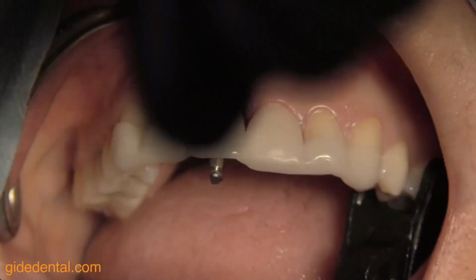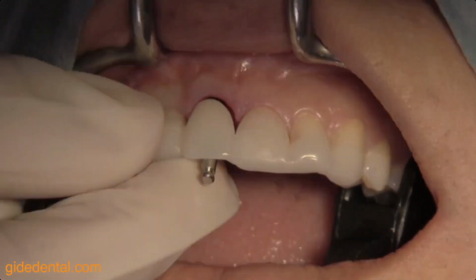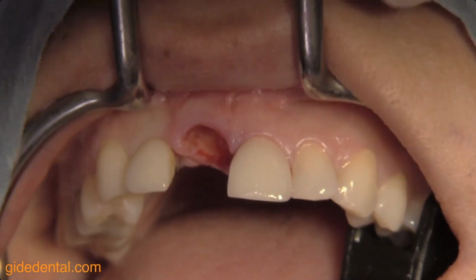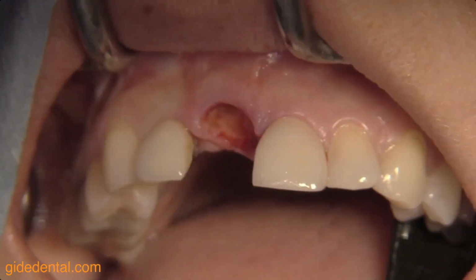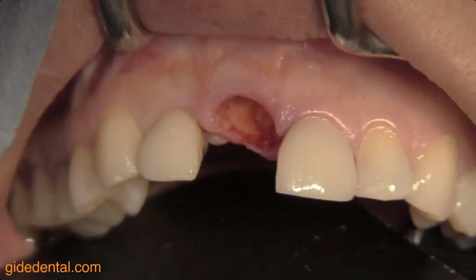Here's the check of that. So you can see I'm frequently always making sure that we're happy with the three-dimensional position of the implant. The depth is also excellent, so we're good. And again, the depth is not as important as long as the anatomy allows me. I can go a little bit deeper if needed because it's not going to be something that I'm going to be using in the final implant position.